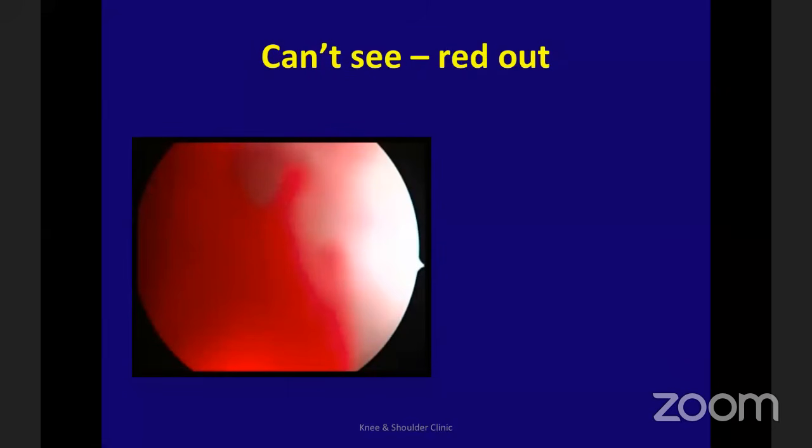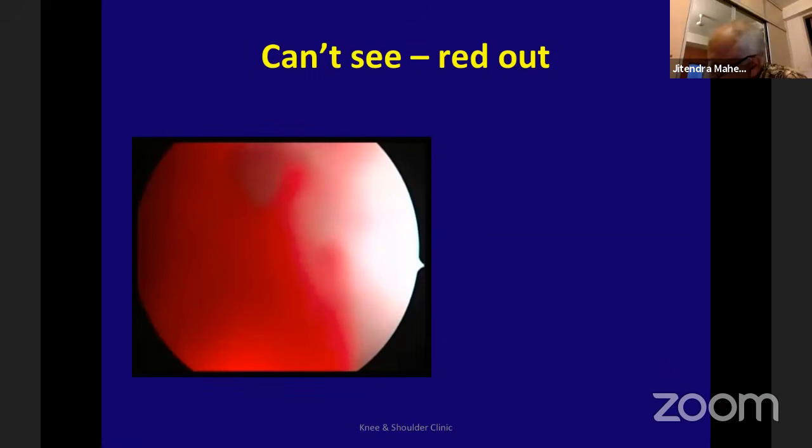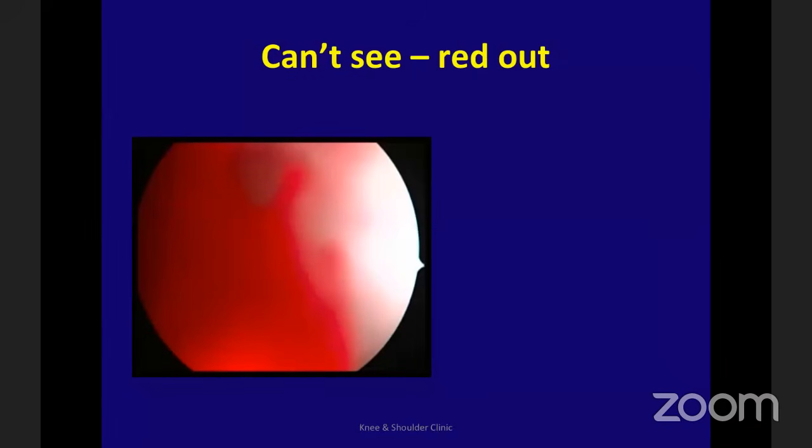Yes, sir. For seeing properly, while inflow of the water or saline is good, it is not enough. But we put holes in the top of the 3 liter saline pints with the needle that comes with the TURP set. When we put the hole and still we cannot see, we cannot use that inflation or BP cuff because of the holes. Are you putting holes, or are you already using that BP cuff in all the patients?